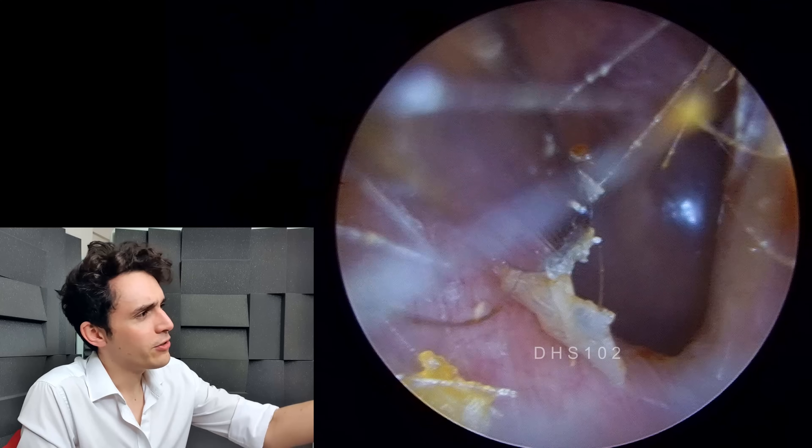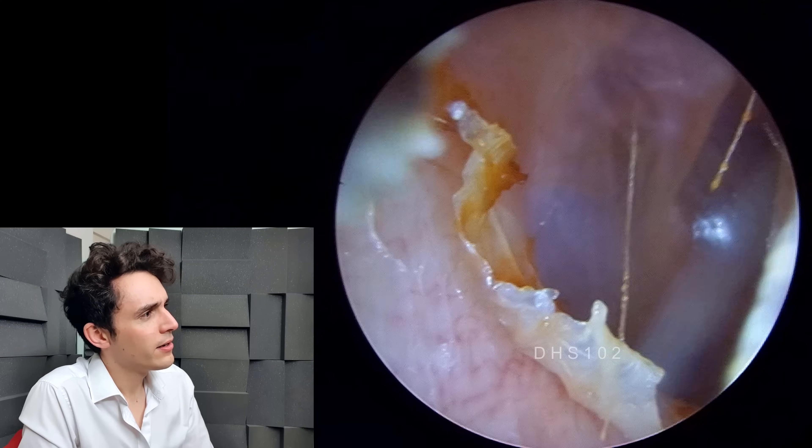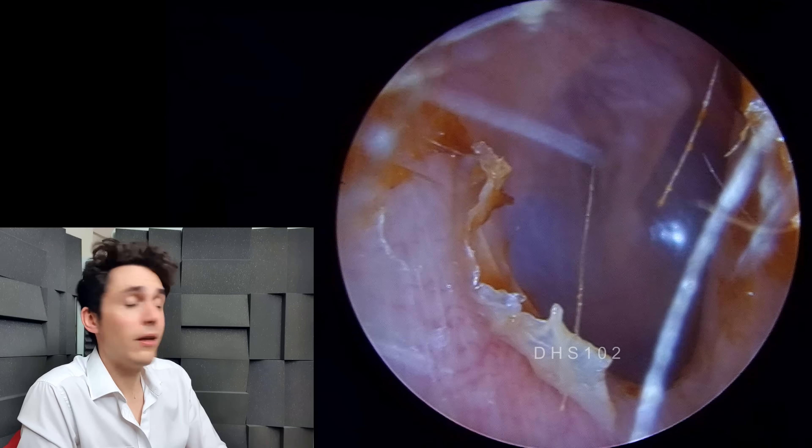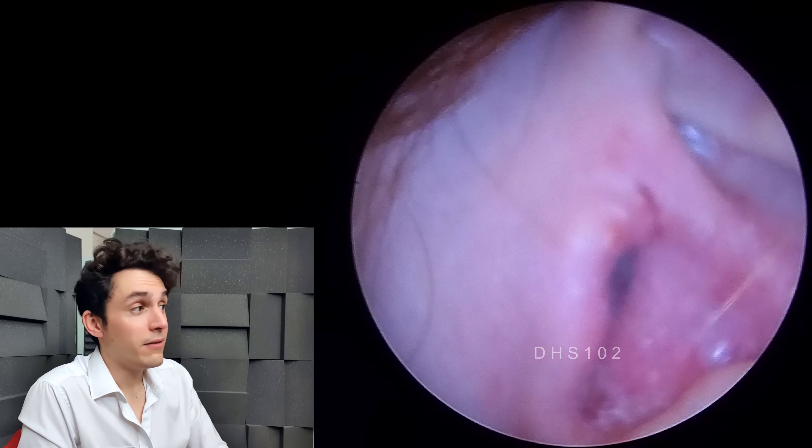And lovely looking eardrum back there — the sort of greyish, shiny skin. There's just a little bit of residual dead skin there, but overall a lovely looking ear. So now I'll show you the infected ear.